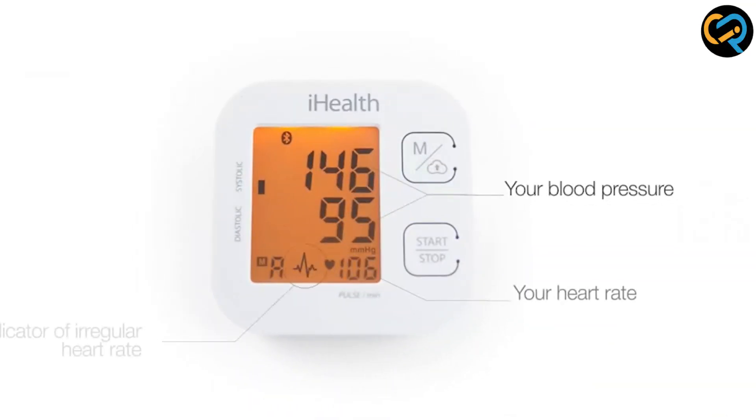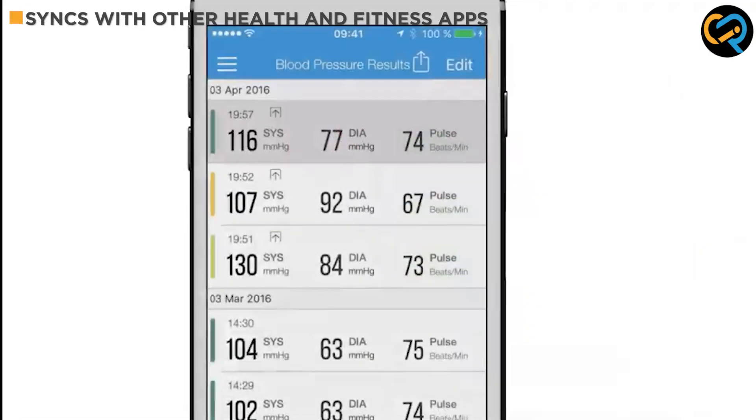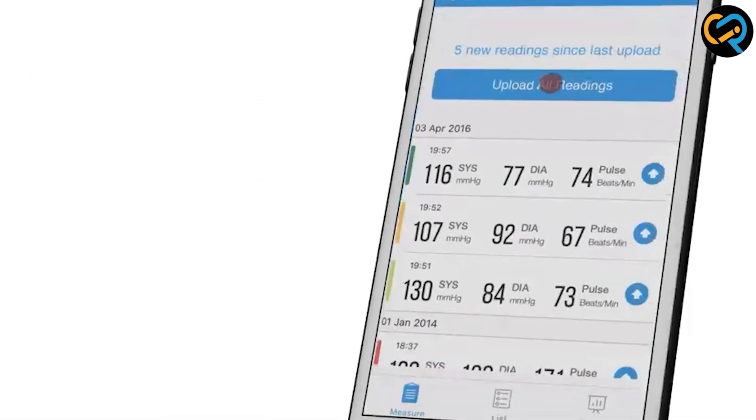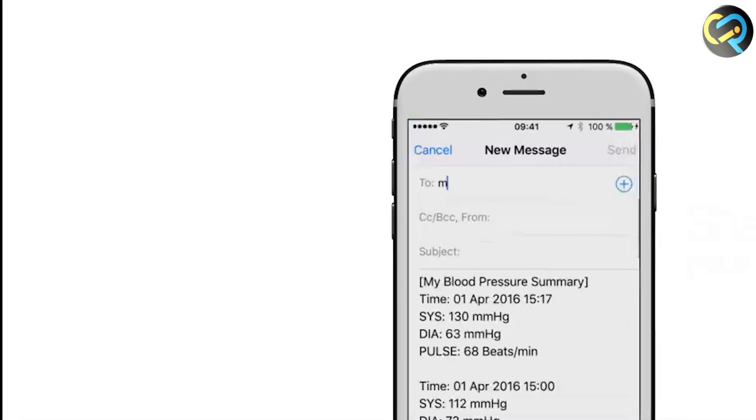Another great feature of the iHealthTrek Smart Upper Arm Blood Pressure Monitor is its compatibility with other health and fitness apps. You can sync your blood pressure readings with apps like Apple Health and Google Fit, so you can get a more comprehensive view of your health and fitness.